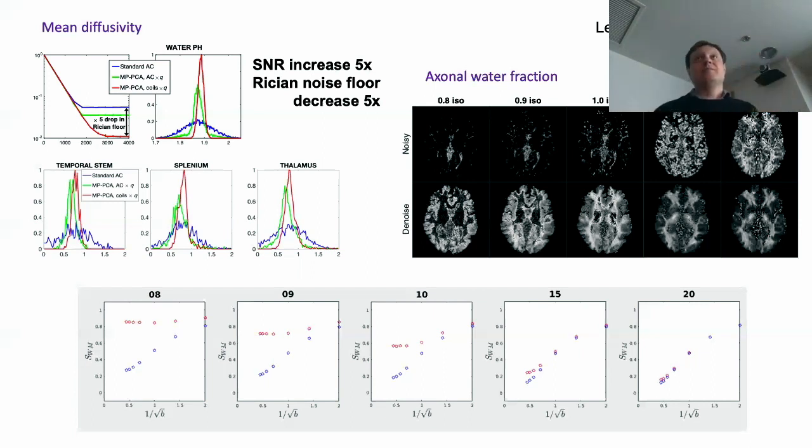So what's the assumption of that truncation? Why do you pick that truncation? Does the data have to be IID, or what does it have to be? So I make it IID, rotating it to the basis where it's IID in noise. Does it have to be IID in signal? No, of course not. And the Marchenko-Pastur distribution, random matrix theory, will tell you where the cutoff is.